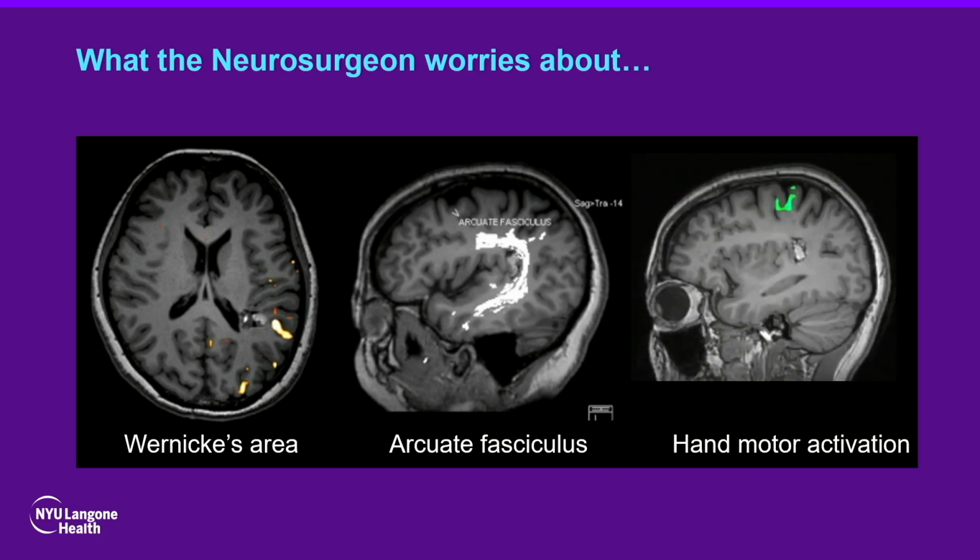The neurosurgeon may actually need to know where the central sulcus is. And the point of this slide is that I'm not going to try to teach you how to do fMRI or tractography, although I am going to give you a 30-second Oprah Winfrey explanation of it. But the idea is that there is a lot of really important anatomy here, and I can use my experience doing brain mapping at NYU to teach you some easier ways to communicate more specifically where lesions are. I think that's very helpful for your referring physicians. It'll improve the value of your reports.